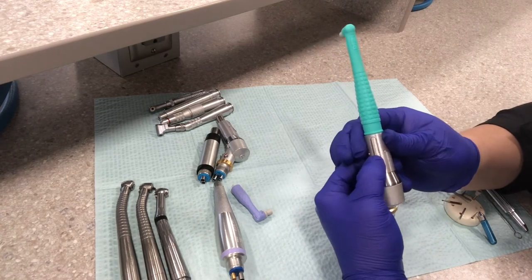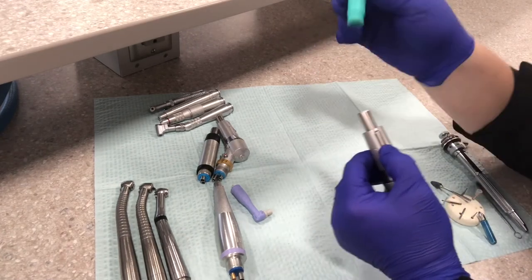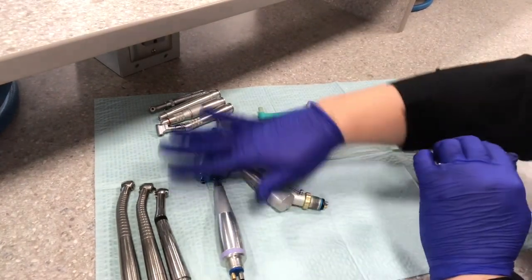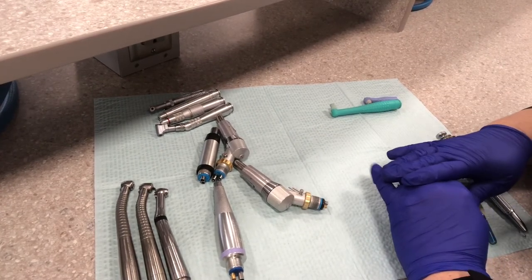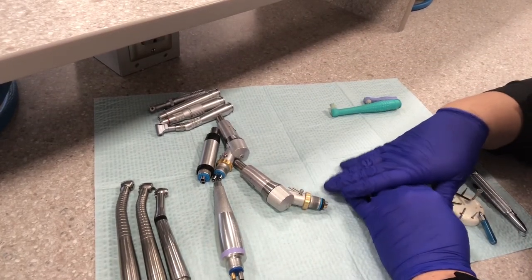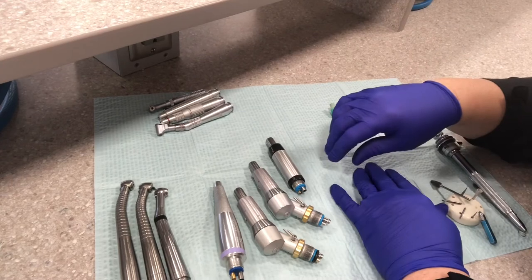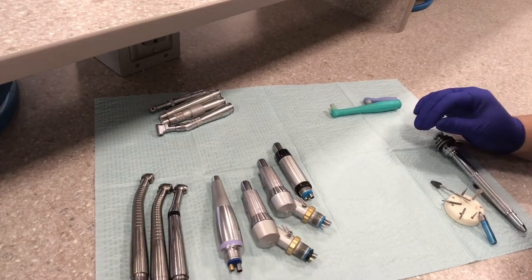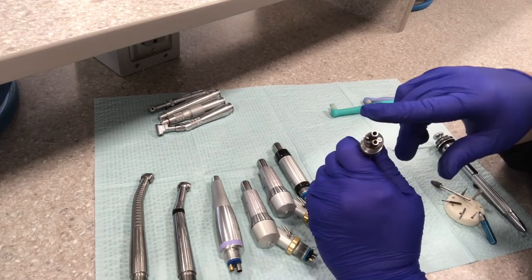You push the little lever here and slide that off — anything plastic is disposable. All the rest — motors and high speed handpieces — are to be sterilized. We never put motors, attachments, or any handpieces in the ultrasonic. They go directly over to the sterilization side where the pouches are and the Cistina, which is the machine that oils the handpieces. We do have to maintain them — they're very expensive — so we need to make sure they stay working properly.